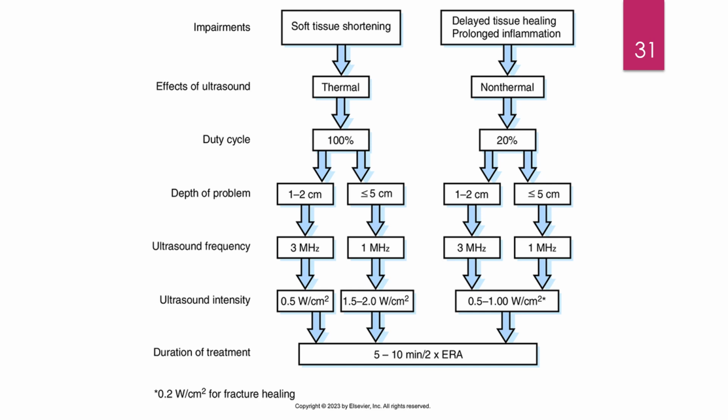Okay, so 5 to 10 minutes, essentially for 2 times the size of the ERA. So 2 times the size of the transducer is what we're looking at, 5 to 10 minutes. Okay, so that's the whole thermal side.